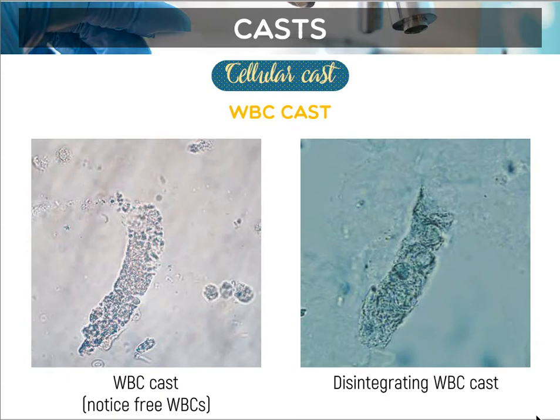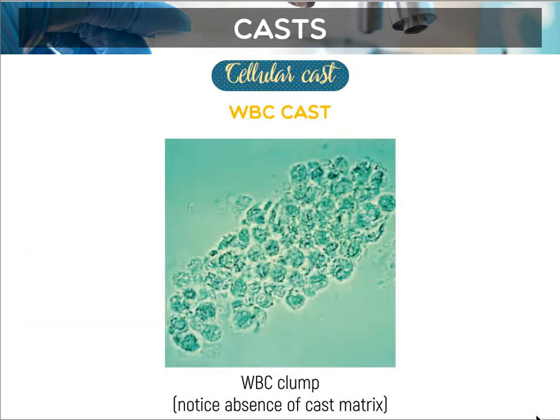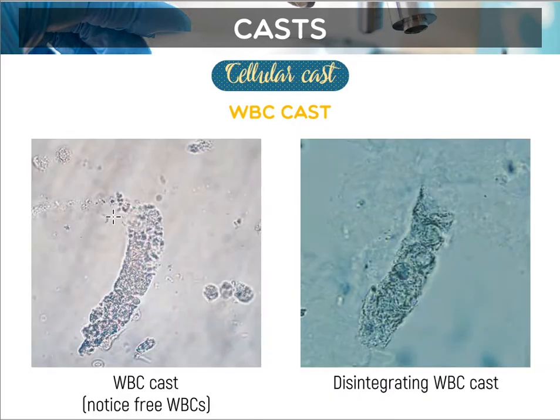Alright. WBC clump. Tanawa, wala siya klaro kay yung matrix guys. Di siya clear edges.